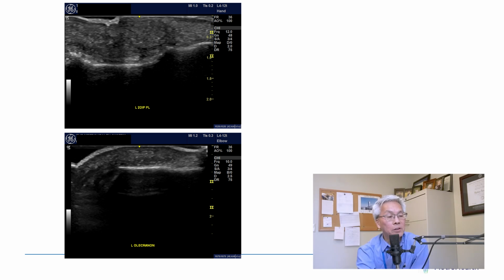The ultrasound over those finger nodules was fairly nondescript, but the main thing is it's not hypoechoic, so it doesn't look like a cyst that I could just stick a needle in. But when you look back on it, it probably does fit a so-called urate aggregate.